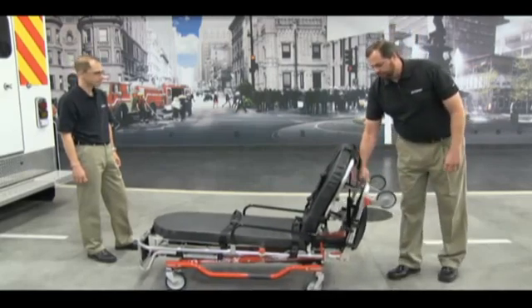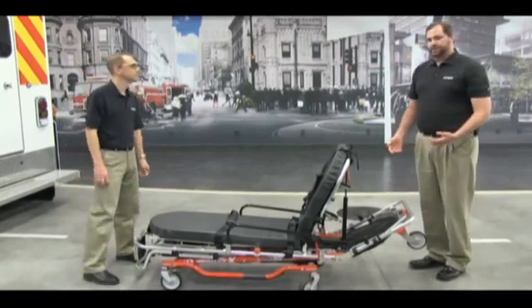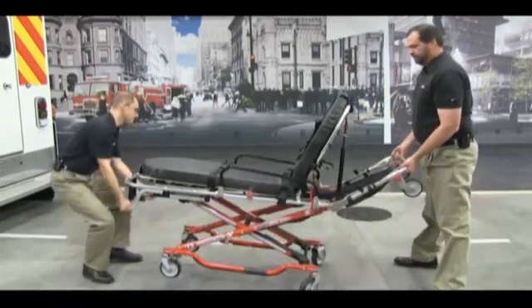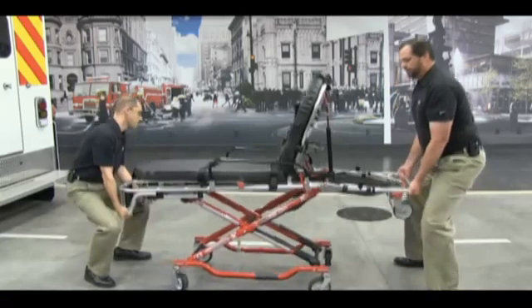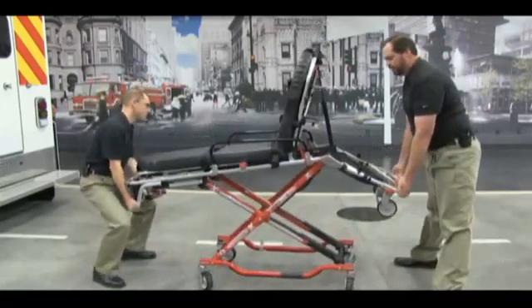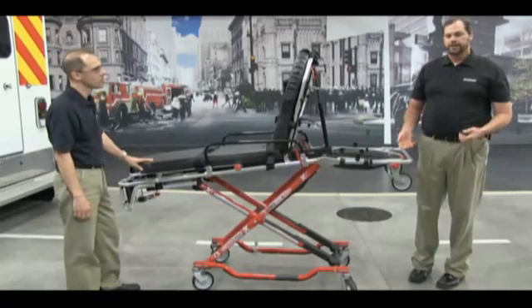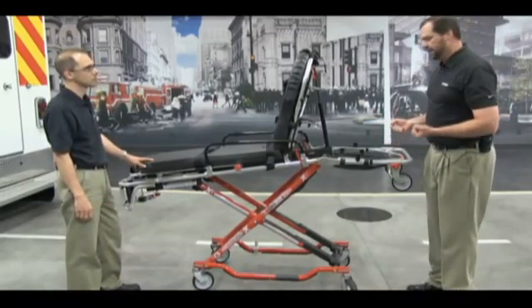The other thing that it does for me is I can put it in a position here, and this allows me to do a 3-stage lift. So I'll demonstrate with Jerry. Come here, then I can lower to here, and then get it up into a load height position here. You'll notice when I did that movement, I never lifted the weight past my belt line. This is going to make sure that you don't have to use your back or your shoulders when you're raising it up.